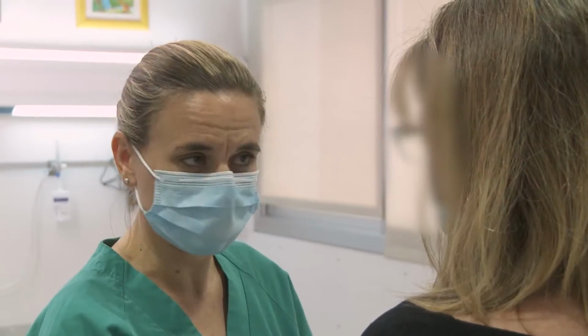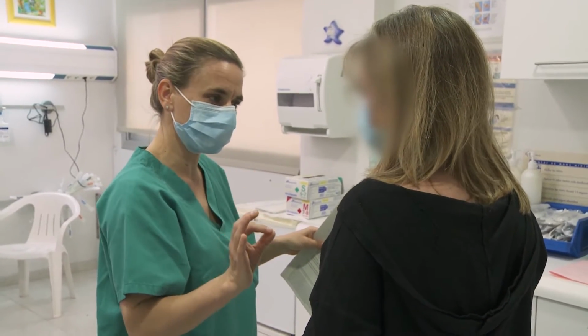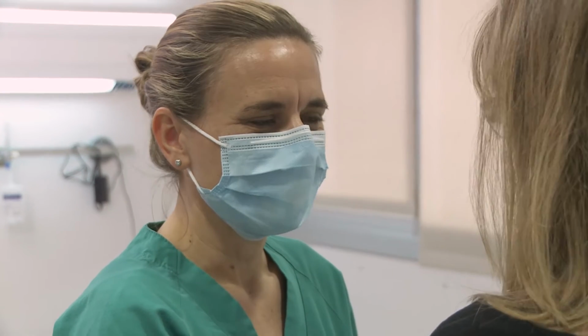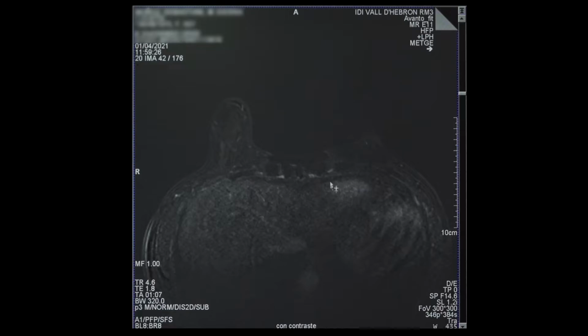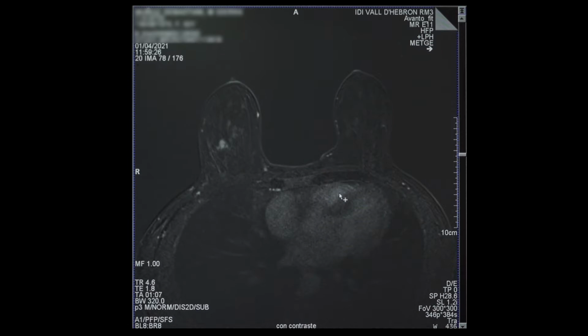Information is provided to the patient so that she is aware of the risks, benefits, and how much her cooperation is needed for a successful MRI breast biopsy procedure. Prior MRI images are reviewed to decide about patient positioning, access side, and placement of the fiducial marker.